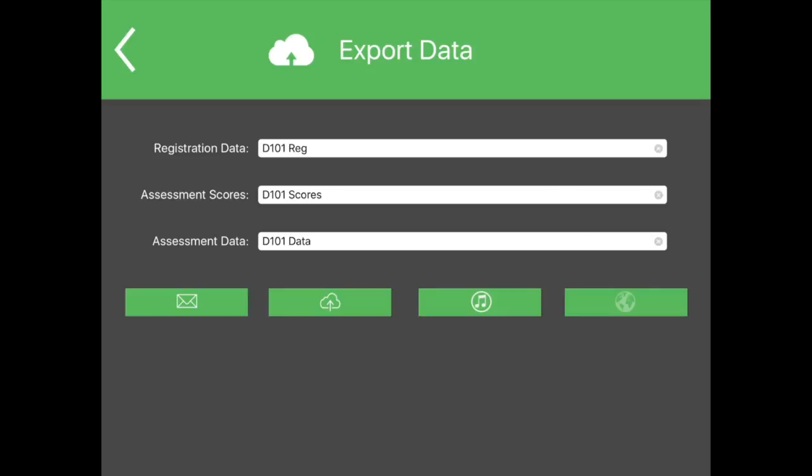Tap one of the four symbols. Tap the envelope symbol next to the file to send the files via email. Tap the iCloud icon for the files to be uploaded to the iCloud Drive account associated with the Apple ID. Tap the iTunes icon for file sharing. Tap the fourth icon for configurable web location. This option is intended for use with an existing web location for data centralization.